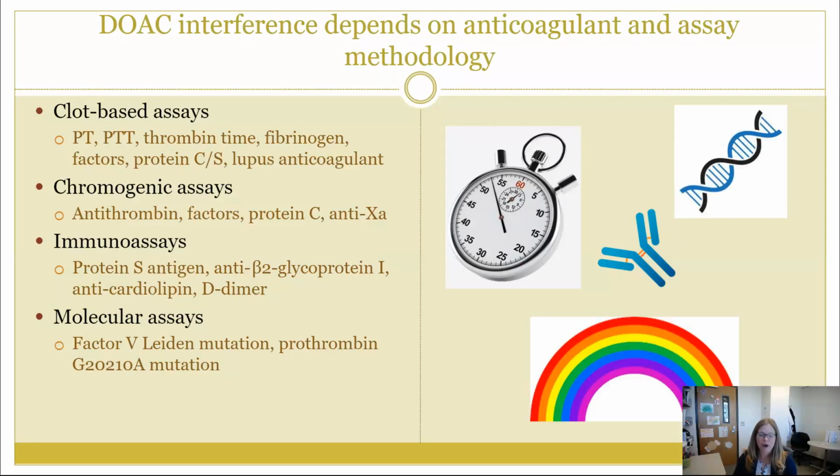Okay, so the answer to this question depends on a couple of different things. First, it depends on which anticoagulant the patient is receiving at the time of testing. And then it also depends on what type of assay methodology we are using in these tests. Within coagulation testing, we actually use a wide variety of different assay methodologies, and it's really important to be knowledgeable about what types of testing are performed in your laboratory. I like to group these into 4 main groups.